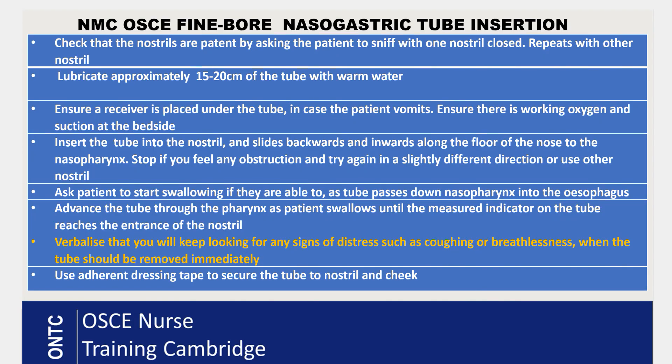Once the NEX measurement is done, check with the patient which nostril is more open, as using the more open nostril is more comfortable. Ask the patient to close one nostril with a finger and sniff with the other, then swap sides. This tells you which nostril is more open, and that is the one you will use for insertion.